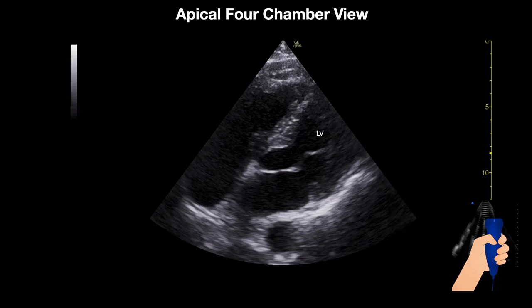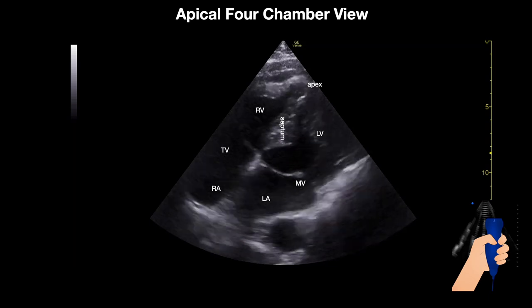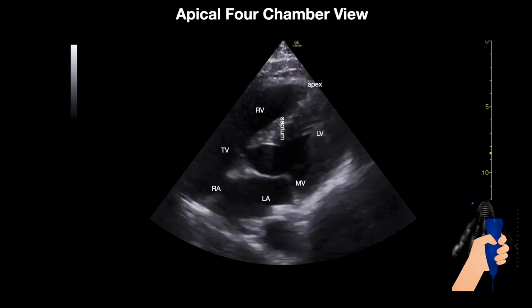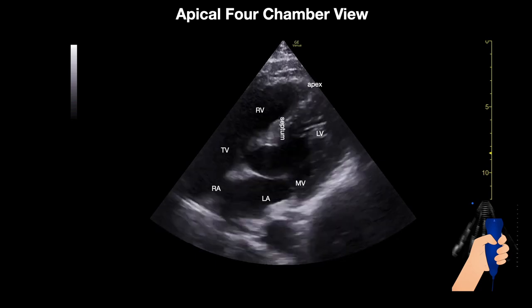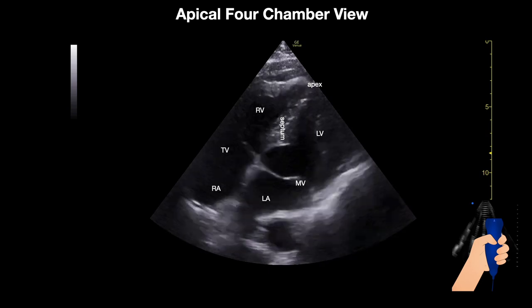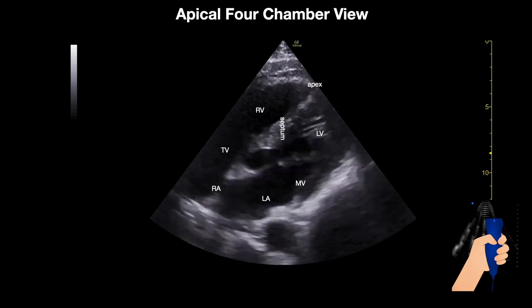This is a different patient. This is the left ventricle, the apex, the septum, the tricuspid valve, the mitral valve, the left atrium, the right atrium, and the right ventricle. This patient was not able to lay down on his left side, hence the difference in position.